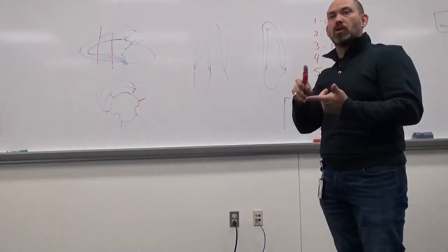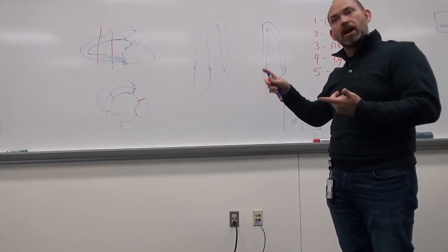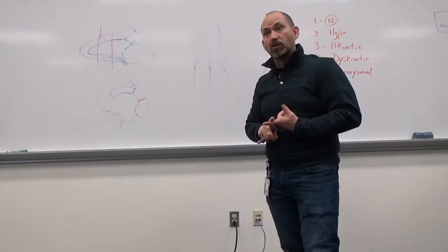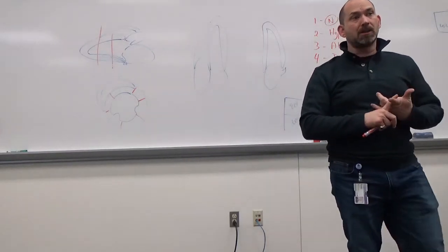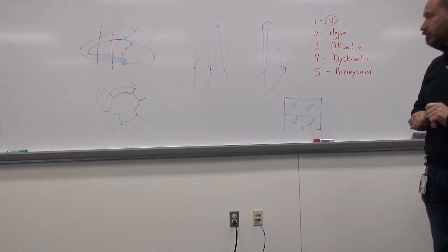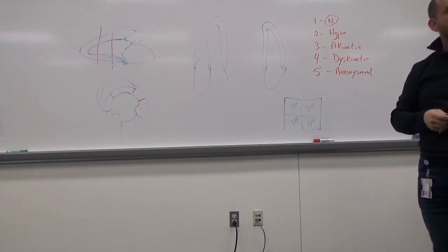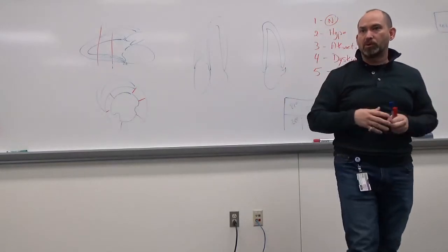We could do it for HOCM. It is risky, and for patients that have high-grade aortic stenosis or HOCM, it could be dangerous. If these patients do go down, they go down hard and you might not get them to recover. Okay, so it is more dangerous. Otherwise, we're looking for physiological changes in diastole as we do the stress test. So we'll do that post-stress.